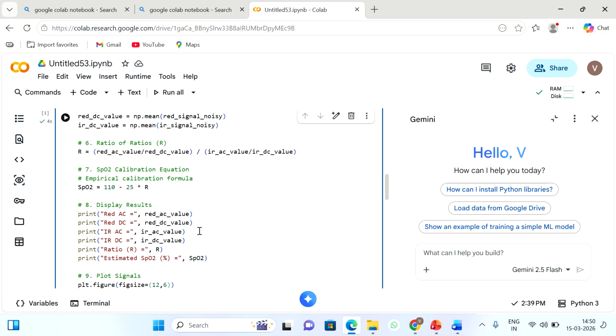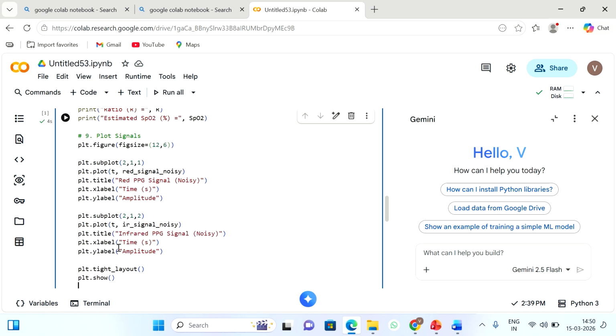Then go to plot the signal. plt.figure, then 2, 1, 1. So it creates a 2 rows, 1 column layout. The top plot is the red signal, and the bottom plot is the IR signal. Then plt.tight_layout adjusts the spacing, and plt.show displays the graph.